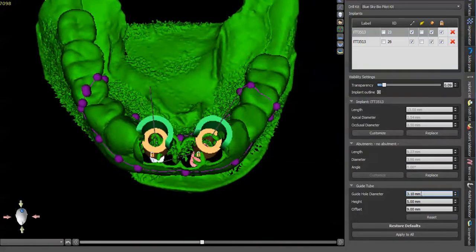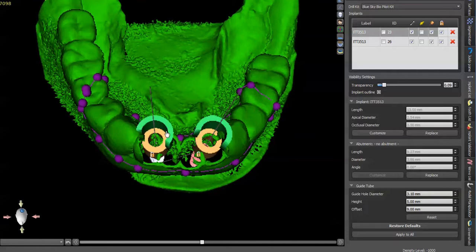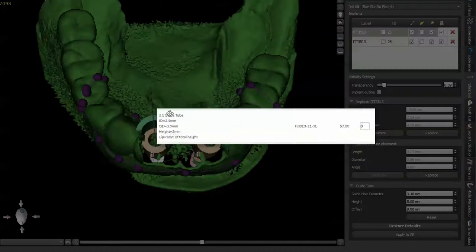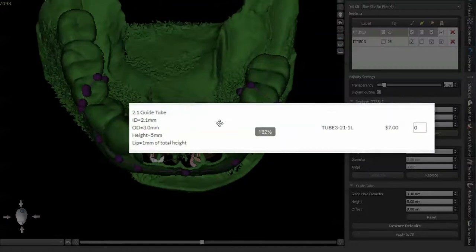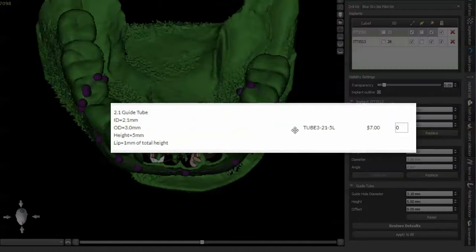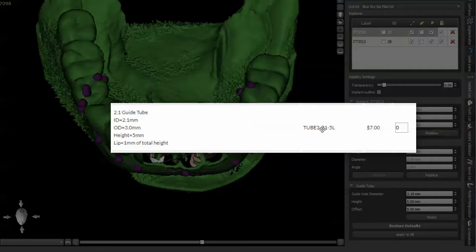The metal guide sleeve tubes that are used for this, the inner diameter, this is the product right here. It's tube 3-21-5L.